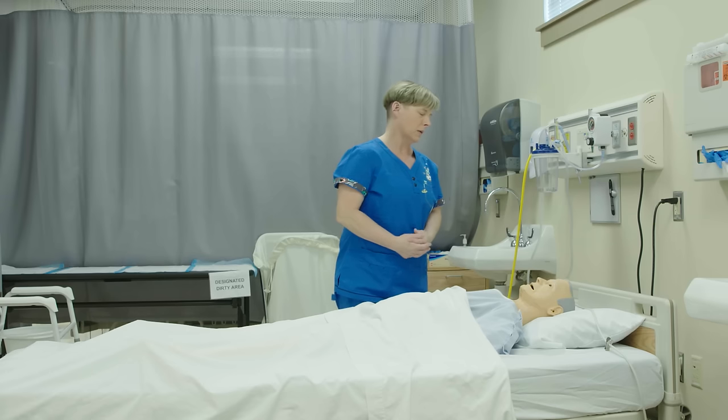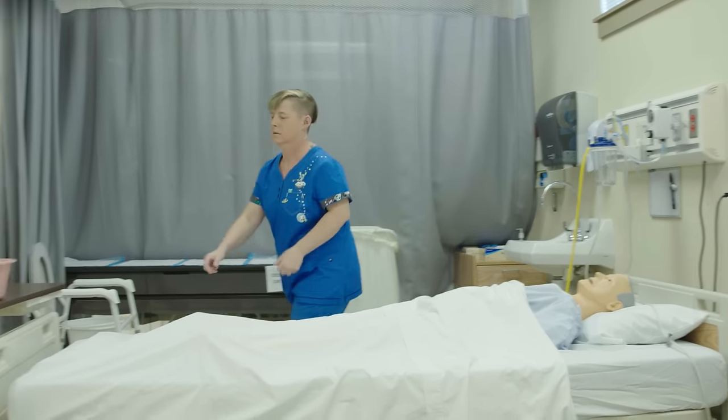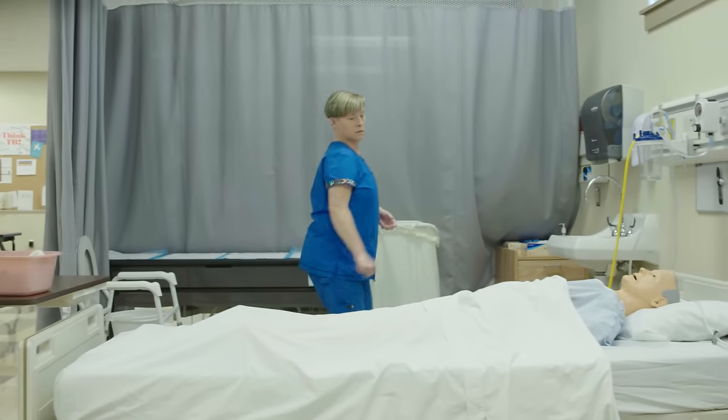Mr. Bragg. My name's Betsy. I'm your nursing assistant today, and I'm here to clean your catheter. Privacy is provided with a curtain, screen, or door. Privacy.